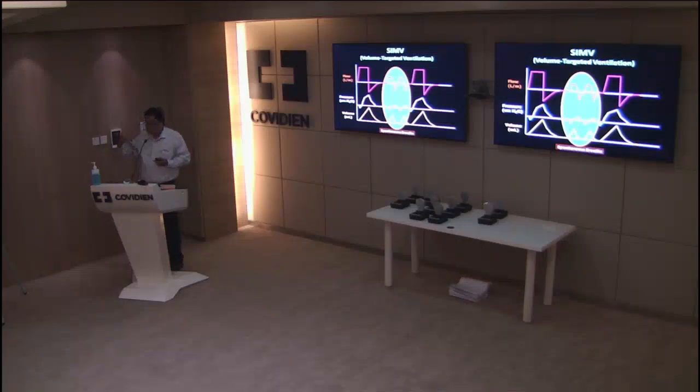But to overcome this extra work, people are doing SIMV with pressure support. So when he's breathing spontaneously, they don't make him just breathe spontaneously, they give a pressure supported breath so that he can breathe spontaneously and get support to open up the valves. But then people say, why do you want SIMV with pressure support? Just have pressure support. Why are you making life so complicated? Just give him pressure support. So actually you have to keep it simple.